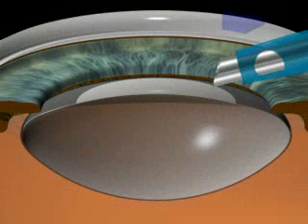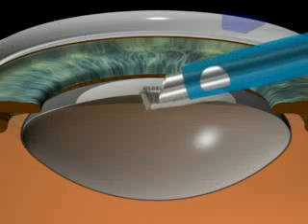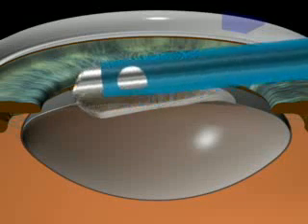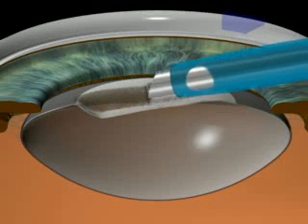Phacoemulsification. A spatula and the phaco tip are inserted through the incisions. The phaco tip starts the downslope sculpting.